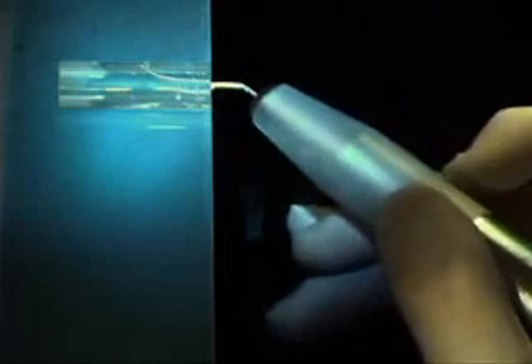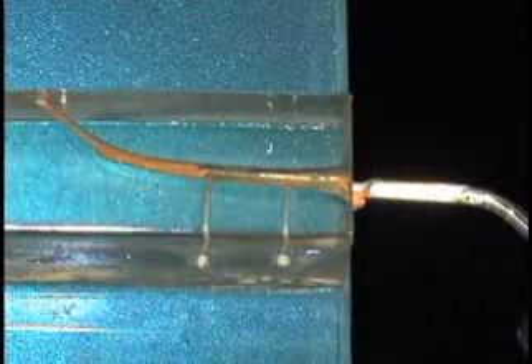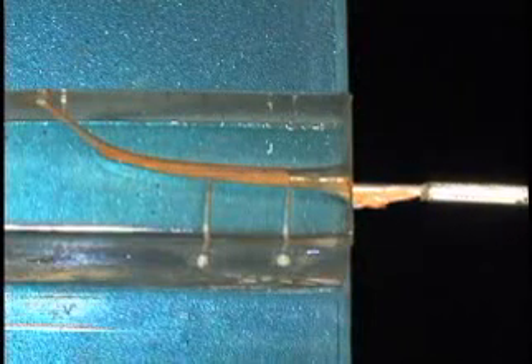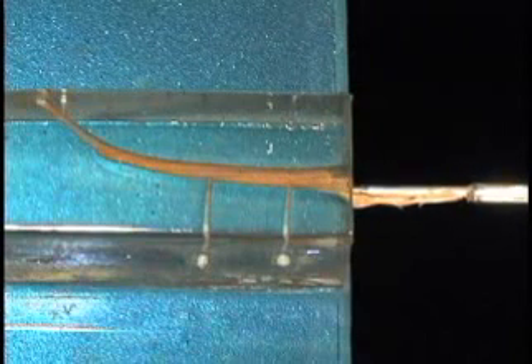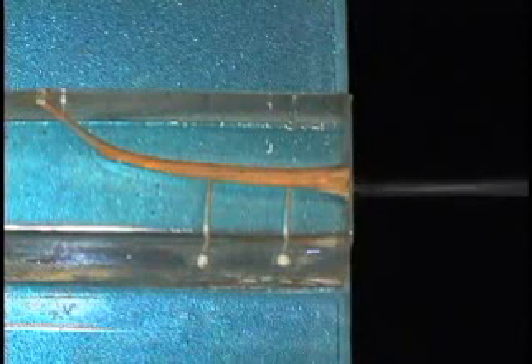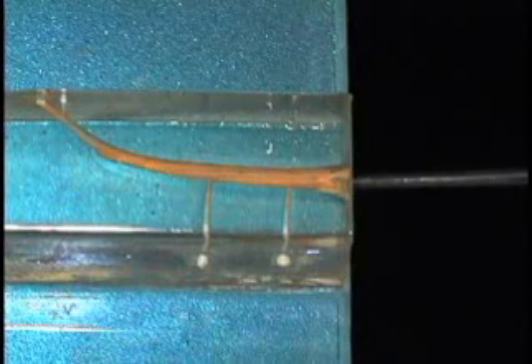Here's the motor-driven inline extruder. We push the forward part of the toggle to prime the needle, giving purchase to the end of the needle. We put it in the canal, wait five seconds to heat the canal with the needle, and push the back end of the toggle — which is a slower extrusion speed — letting the extruded gutta percha push the needle out of the canal to the orifice level. You can take the fat end of the plugger to cut off the surplus gutta percha at the orifice level, then condense until firmly set. At that point it's a very three-dimensional fill.